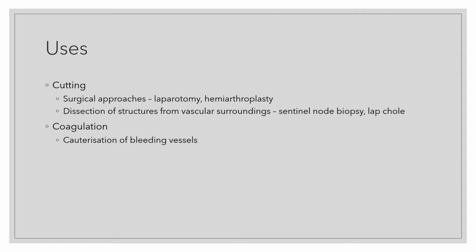It's also used for coagulation, as I've mentioned, and that's for more formal cauterization of bleeding vessels. You can often find that as you use the cut setting and go down through tissues, you still do have some bleeding points which need coagulation with a different diathermy setting.